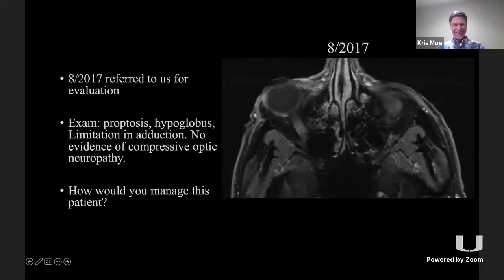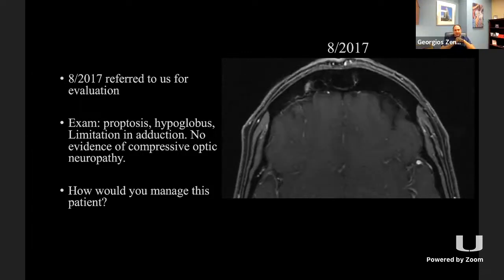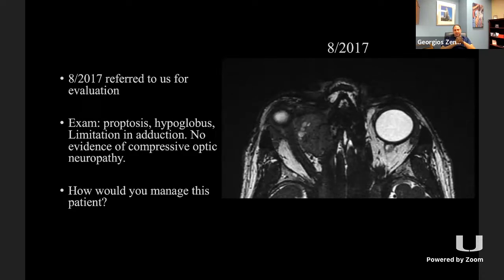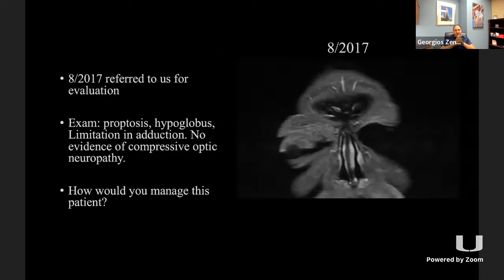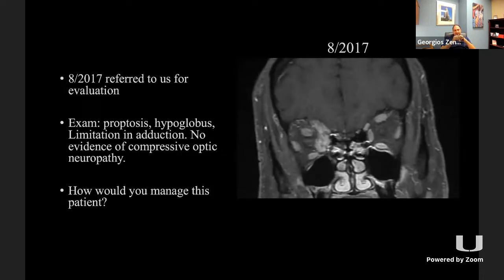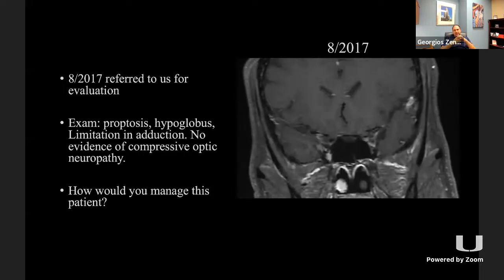George, you want to go first? Yeah. So what was the incision? It was a Lynch incision that was used. Yes. I think this is still sort of the optimal trajectory. To Dr. Moe's point here, potentially trying to expand that. Obviously, that's going to be a bloody tumor. Trying to expand that to have multiple trajectories, potentially even with an endonasal corridor as well. So combining the two, I think having non-stick bipolars and a microscope, and potentially the endoscope available from both portals, as well as ultrasound potentially, I think that's going to be key here. But with the progression and the symptoms, I think it's warranting resection.